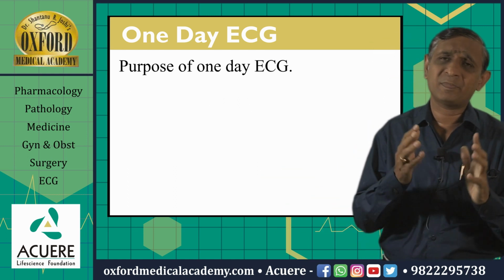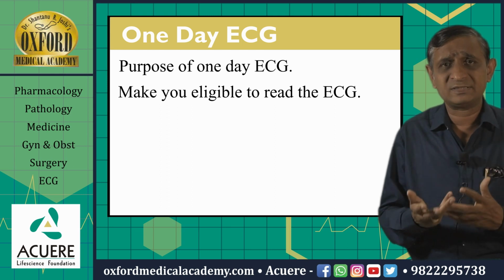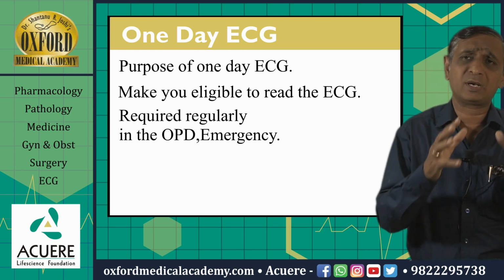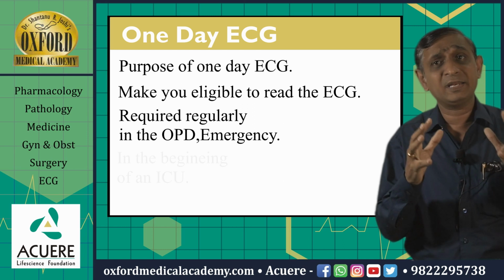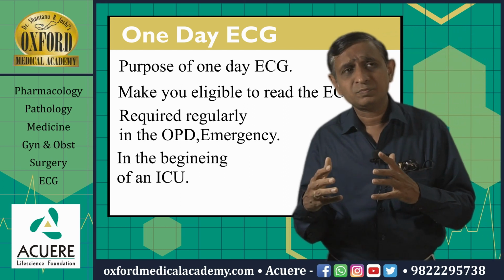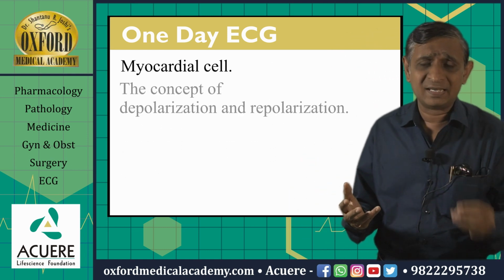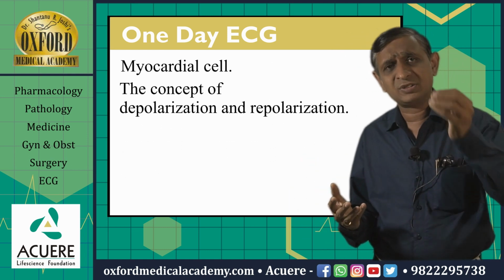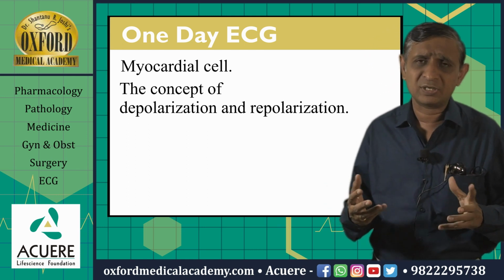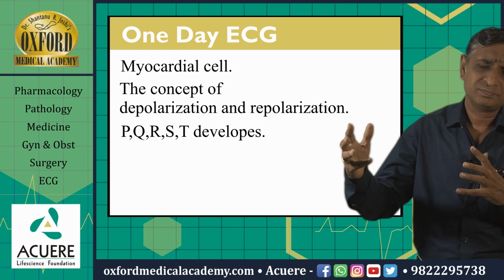In one day ECG, my purpose is to make you eligible to read the ECG which you require regularly in the OPD, in emergency, and in the beginning of an ICU. We practically start with the myocardial cell, the concept of depolarization and the concept of repolarization. Then we see how the PQRST develops.